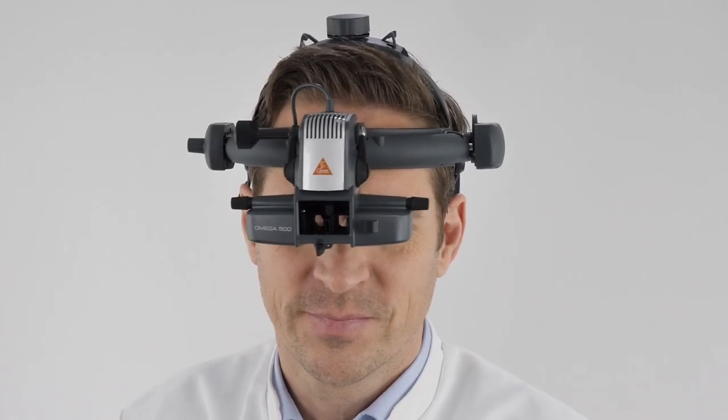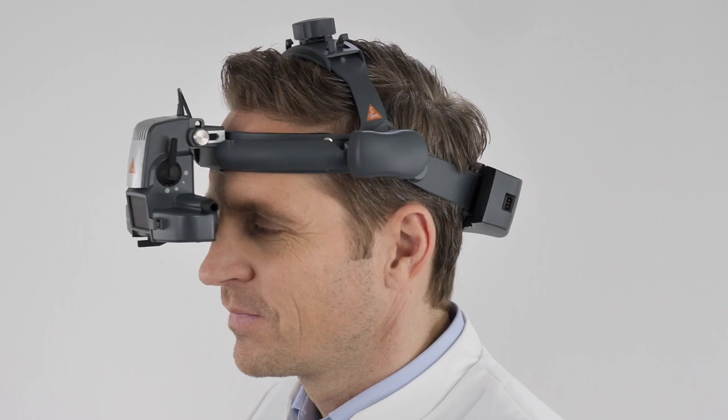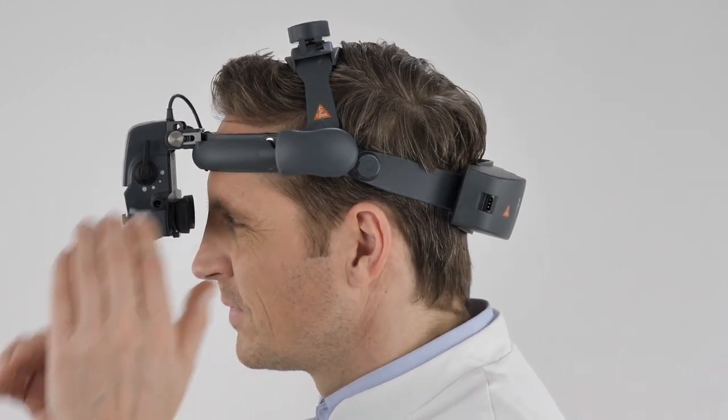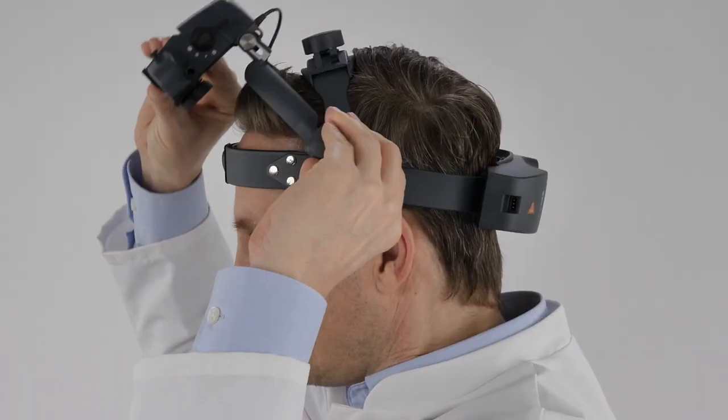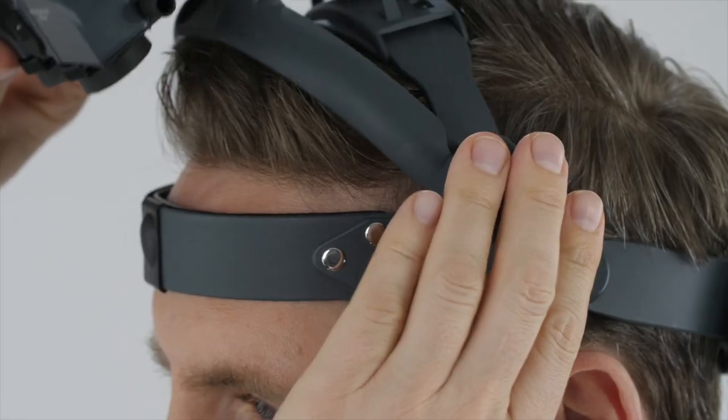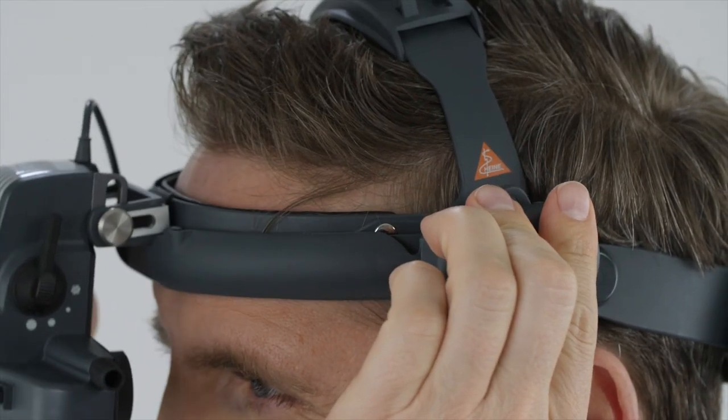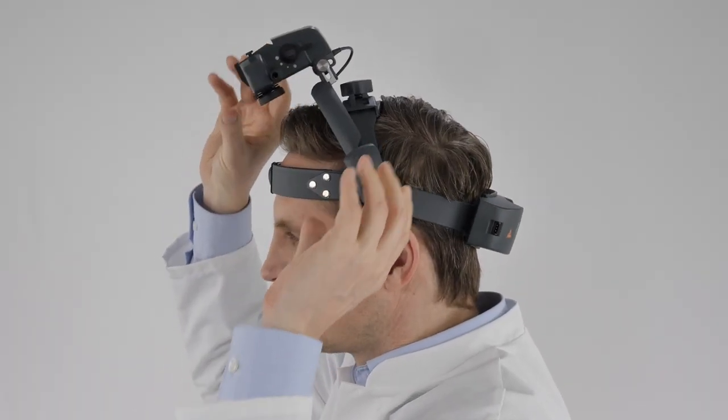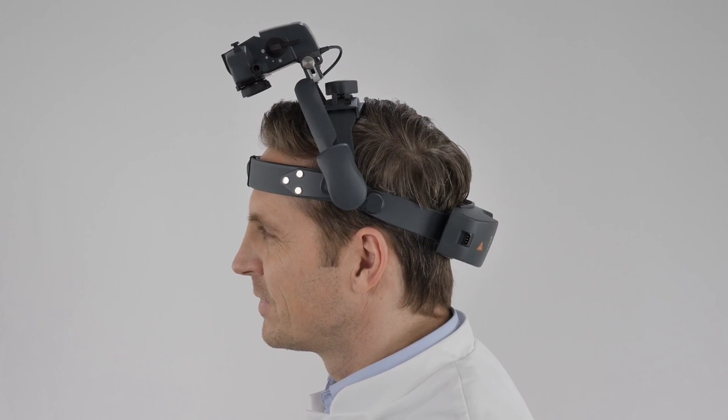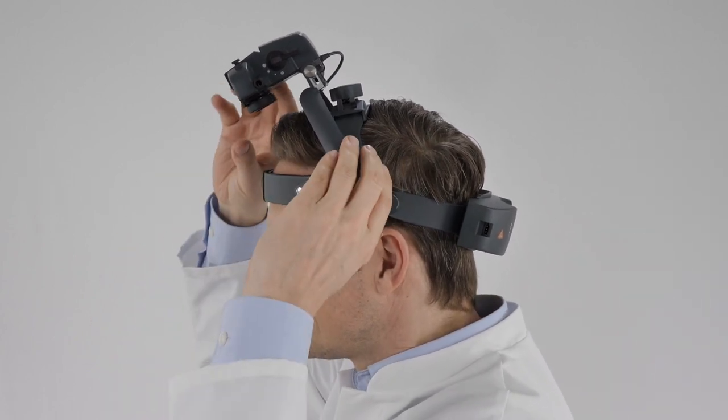First, make sure the optics carrier is in working position. Then put your left hand on the large position control on the left side of the headband. This allows you to adjust the optics up or down. The advantage of this design? You can fold the optics unit upwards into a rest position, for example, for a short patient conversation.